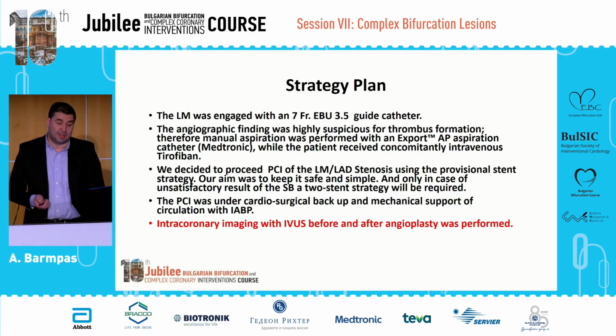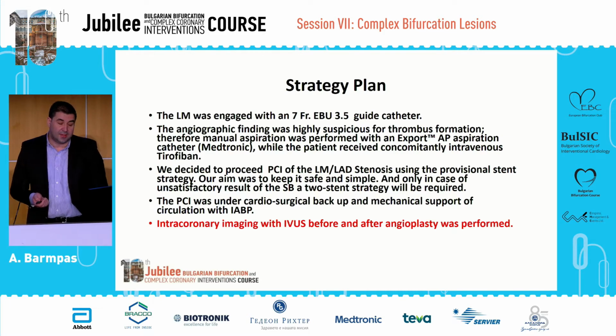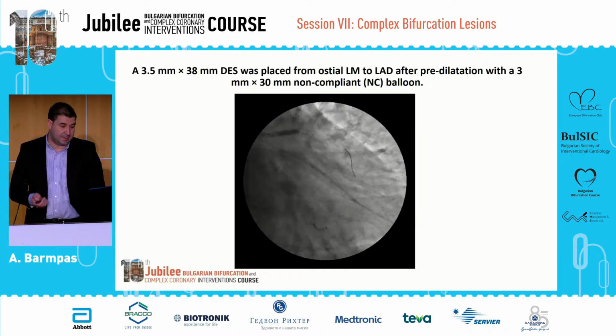We decided to proceed with PCI of the left main LAD stenosis using the provisional stent strategy. Our aim was to keep it safe and simple, and only in case of unsatisfactory result of the side branch, a two-stent strategy would be required. The PCI was under cardiosurgical backup and mechanical support of circulation with an intra-aortic balloon pump. Intracoronary imaging with IVUS before and after angioplasty was performed.